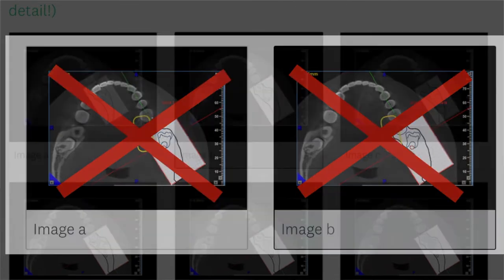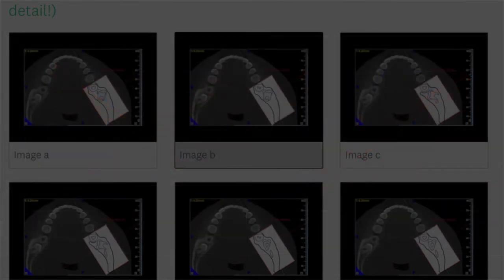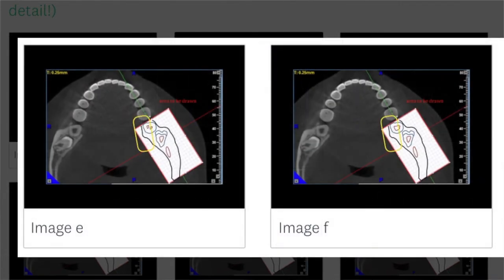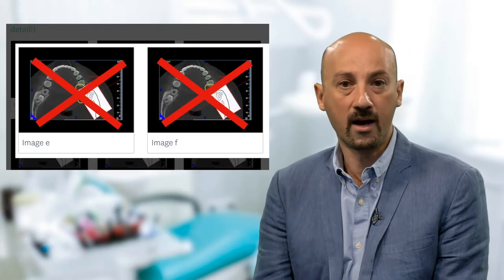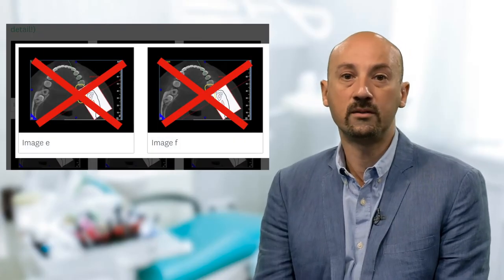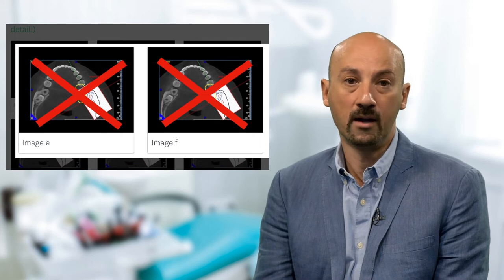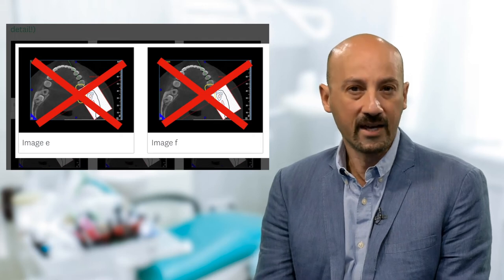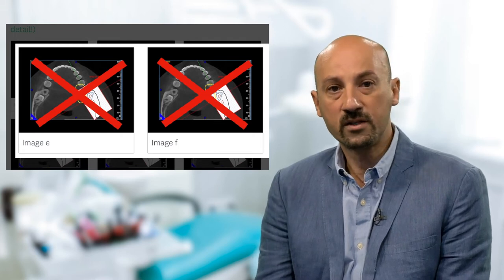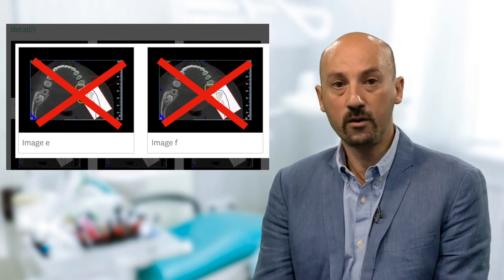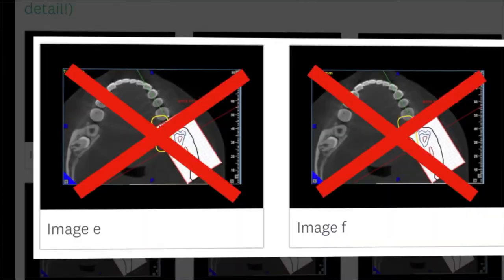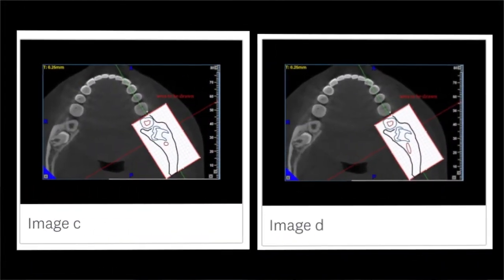Also, slices E and F are to be discarded for the same reason. There might be many more observations we can have with regards to the angle of the wisdom tooth, for example, but at this stage this observation is enough to leave us with only two slides to choose from: C and D.